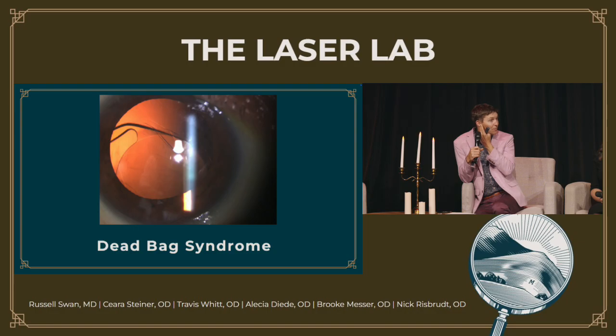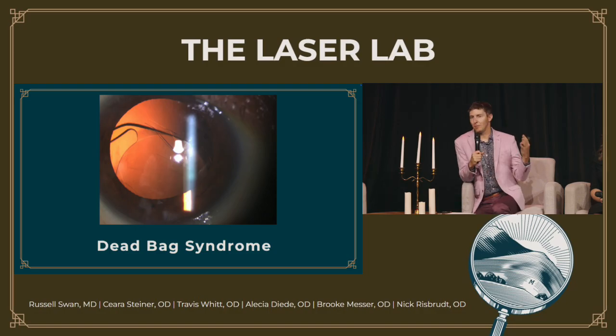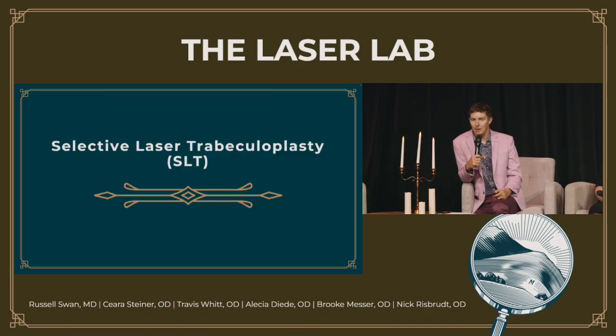This is called dead bag syndrome. It's usually seen with a one-piece IOL, and it's not really well understood, but there's literally no inflammatory response to the capsule healing around the IOL. This can show up 10, 20 years down the road, and the whole capsular complex along with the lens will disintegrate, or sometimes the capsule will get so thin that the one-piece IOL will cut through the posterior capsule and the lens will dislocate spontaneously. These are usually patients that have to be explanted and then have something done. So not a YAGgable save, but you can sometimes get questions about it if it ever comes up.